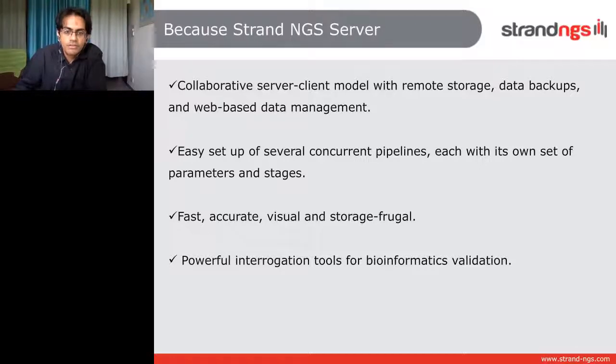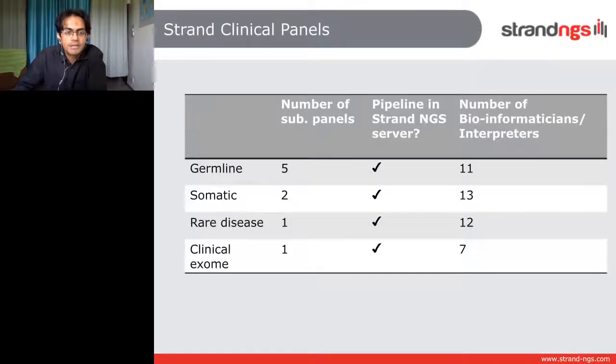So these are some of our Strand clinical panels and the kinds of strengths that we need to support each clinical panel. And of course, each panel has a sub-panel, and each sub-panel has a pipeline in Strand NGS Server.